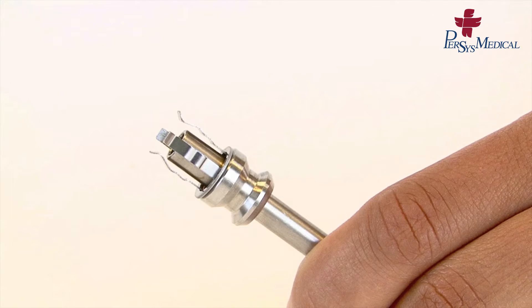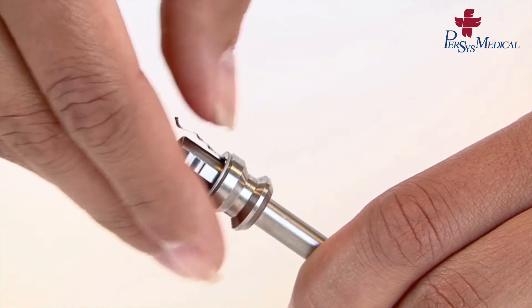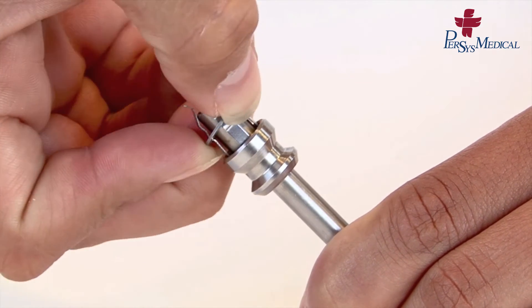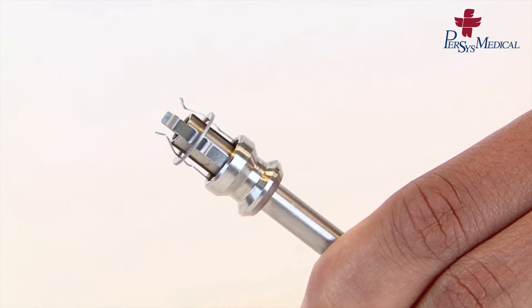Take the piston and raise the washer so that it sits halfway up the clasp. It should sit in the special groove provided.